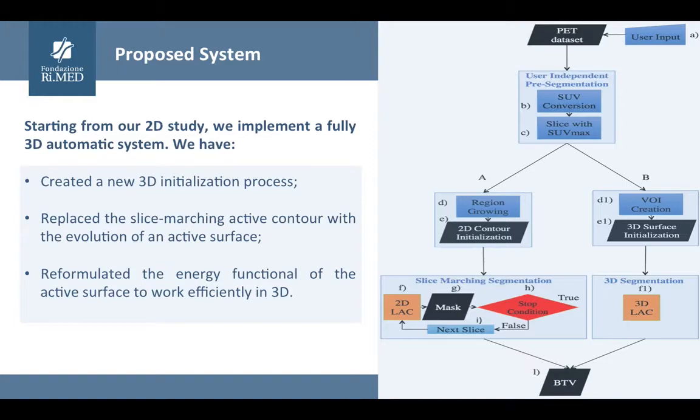To obtain a fully automatic segmentation, the initial 3D mask enclosing the tumor must be obtained without any operator intervention. Consequently, the system identifies the PET slice containing the maximum SUV in the whole PET volume by taking advantage of the great sensitivity and the specificity of the radiotracer in the discrimination between healthy and tumor tissues.